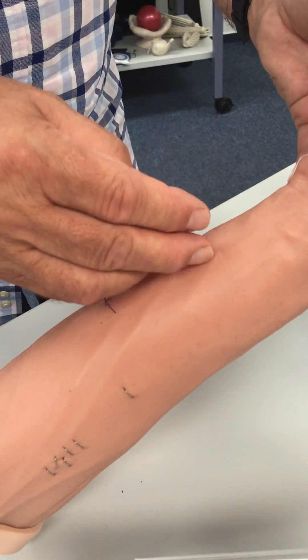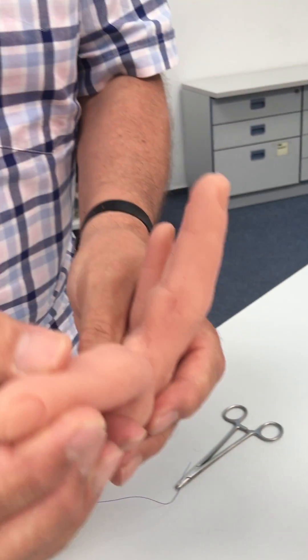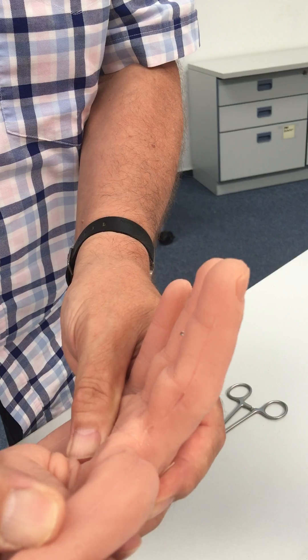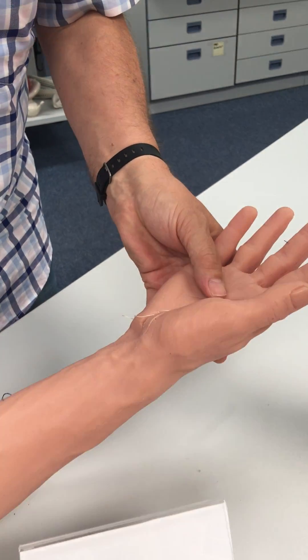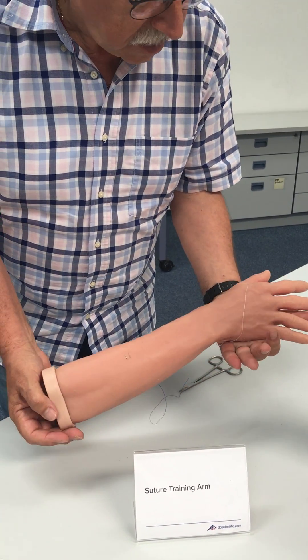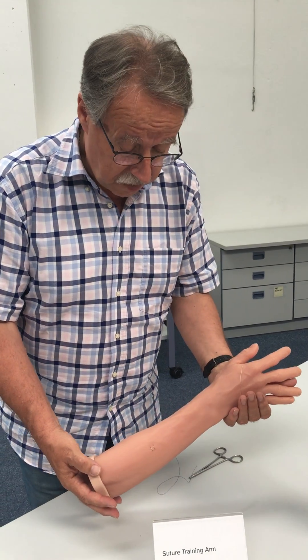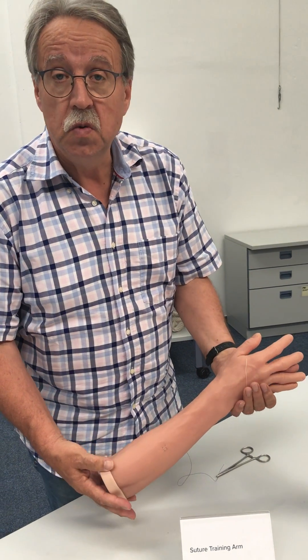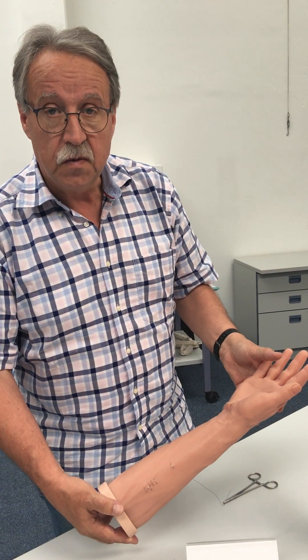You can cut and suture everywhere, even in different difficult places — for example, between the fingers. The hole has a realistic size and there is a nearly unlimited number of sutures you can train with this device. Thank you.